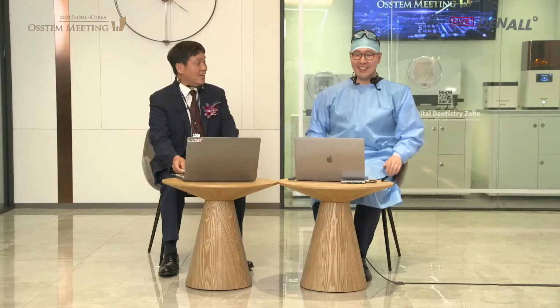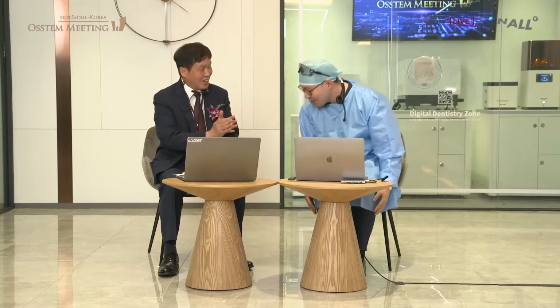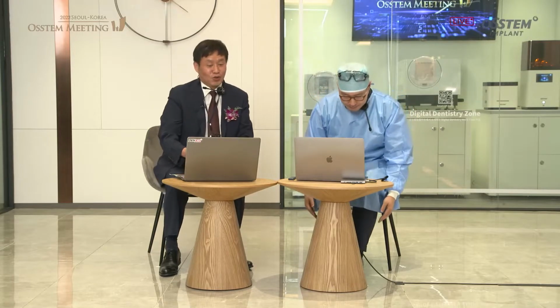There was a quite complicated case, fully edentulous case. Dr. Chung, fine here. Congratulations, hard work. It's very successful, wonderful. It's been placed as planned. A lot of questions are being raised.